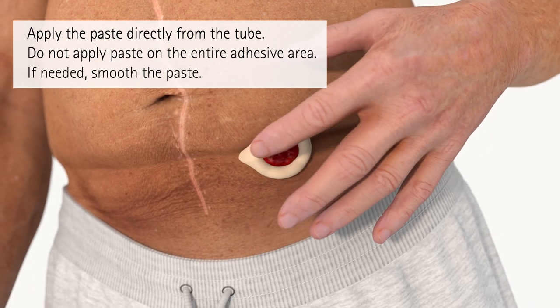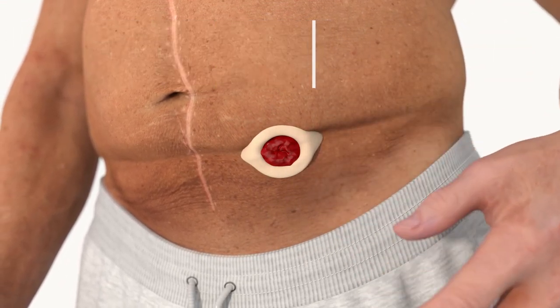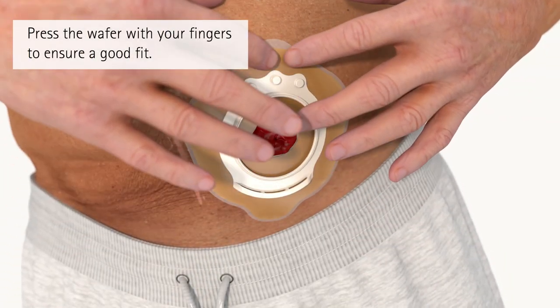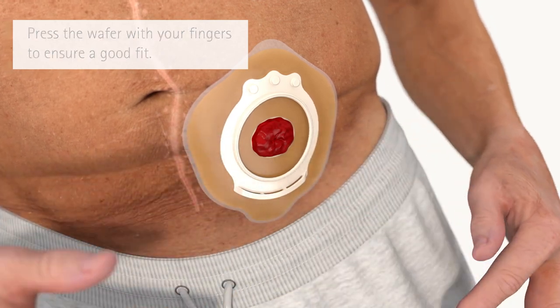If needed, smooth the paste using moistened finger swabs or tissue. After applying the wafer, ensure a good fit around the stoma by pressing the wafer with your fingers.